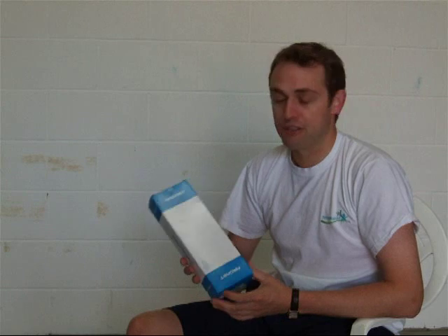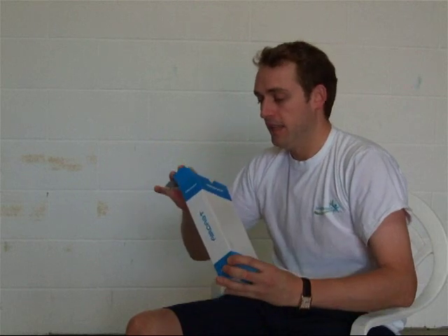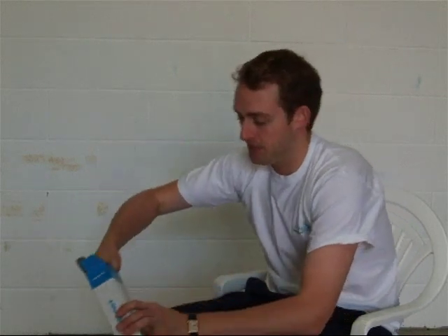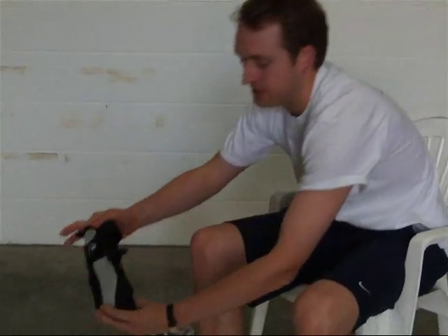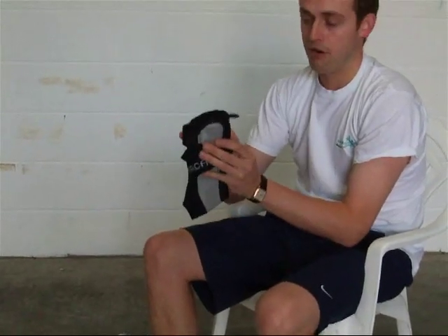I'm Michael Davison, Managing Director of First Day for Sport, and this is the Aircast A60 Ankle Brace. The Aircast A60 is one of our best selling ankle braces because this is the ankle brace as worn by Andy Murray.